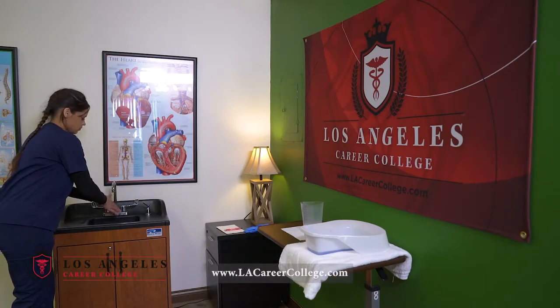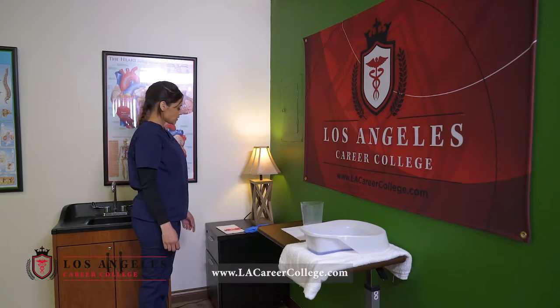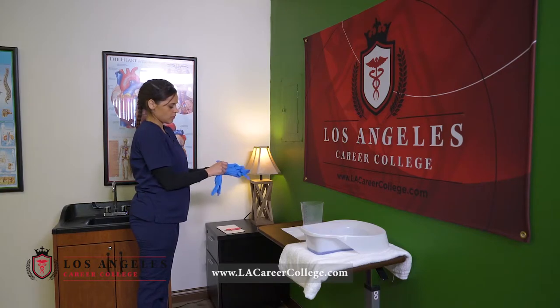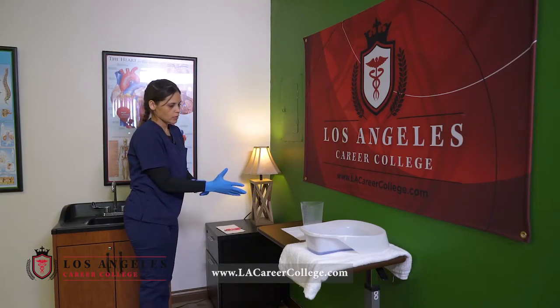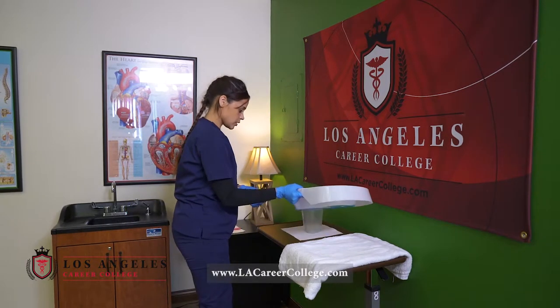Wash hands before handling the bedpan. I will apply one set of clean gloves. I will then pour the continence contents into the graduated cylinder.